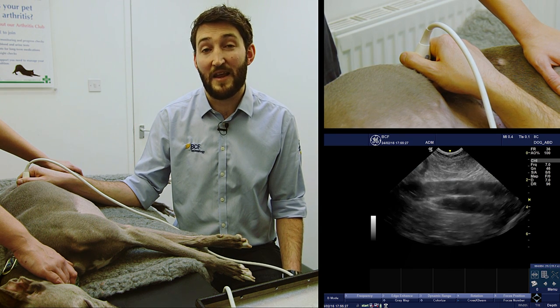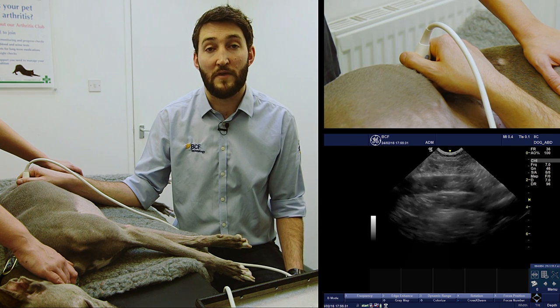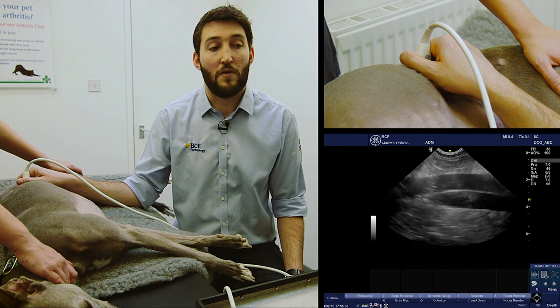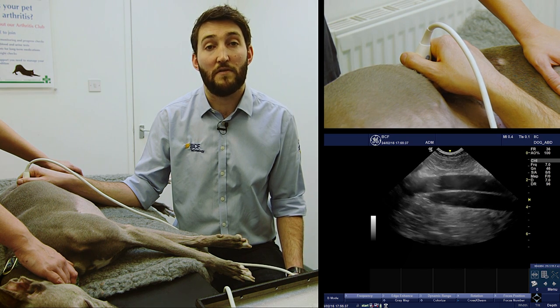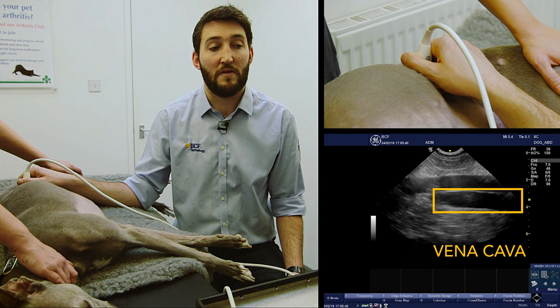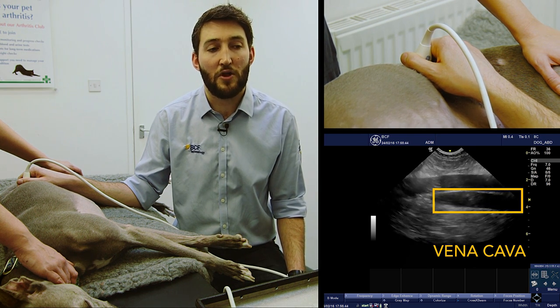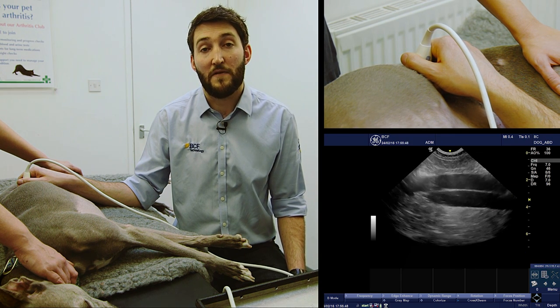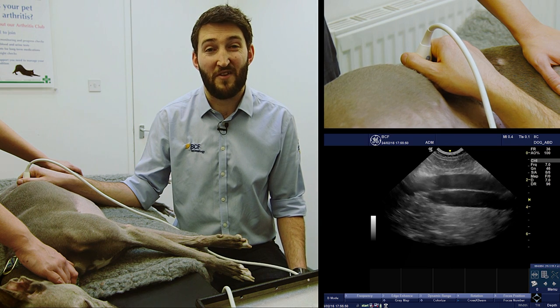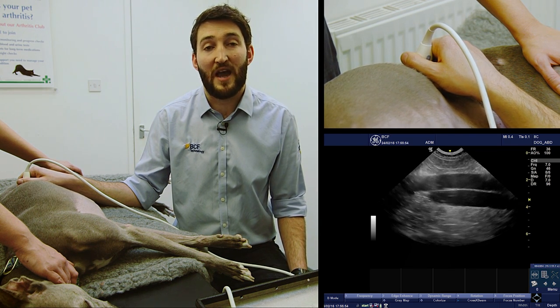Just remember we're scanning from the left hand side — the aorta lies to the left of the vena cava in the abdomen — so the top of the screen represents the left of the dog. That upper vessel is the aorta and the lower vessel is going to be the vena cava. Just be aware that if you watch closely, the pulsatile nature of the aorta is actually creating a sort of referred pulse within the vena cava, so it can be a little bit misleading.